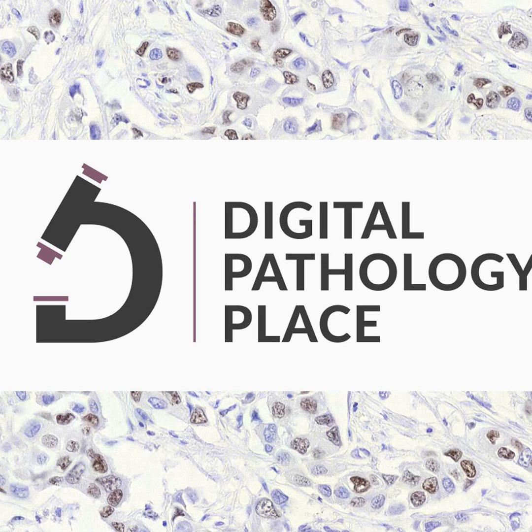That's your basic check. Okay, so qualification is like the mechanical checkup. Does the scanner scan properly? Does the software load? Yeah. And they break that down further, right? Design, installation, operational, performance qualification: DQ, IQ, OQ, PQ. Precisely. Those are the steps to confirm the equipment itself is sound. Now, validation. That's the next level up.